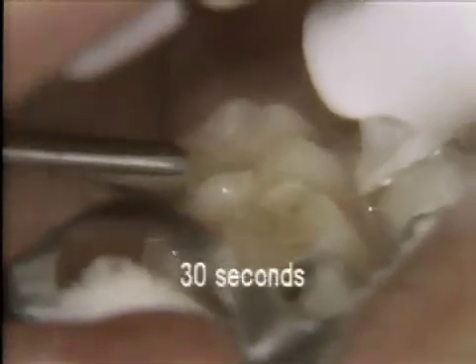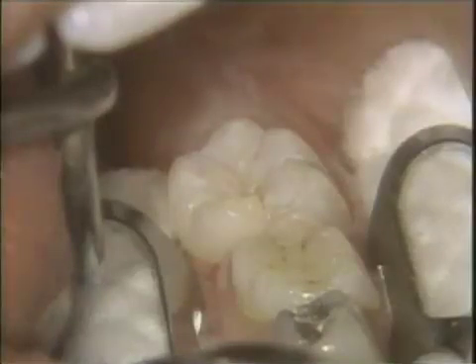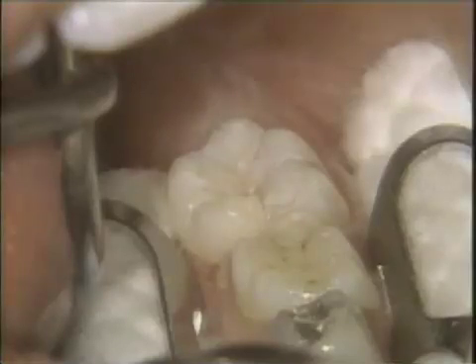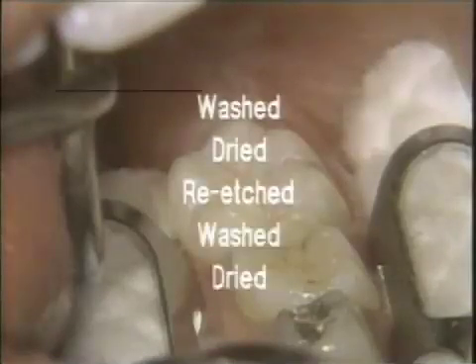The acid etching material and its reaction products must be removed by washing the tooth. This can be accomplished using an air-water spray for at least 10 to 15 seconds if a liquid etch is used, or at least 30 seconds if a gel etch is used. The tooth is then thoroughly dried with compressed air that should be oil- and water-free. Care should be taken to avoid blowing saliva onto the etched surface, which will now have a frosted appearance. If contamination should occur, the surface must be washed, dried, re-etched for 15 seconds, and then washed and dried again before proceeding.